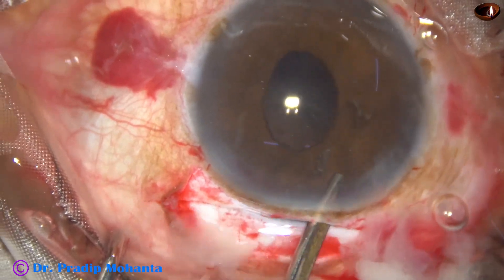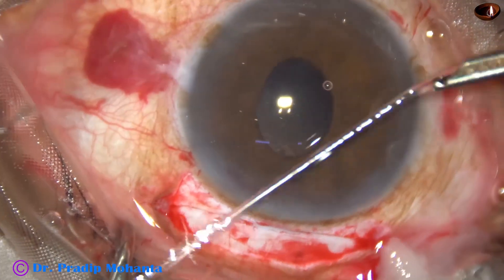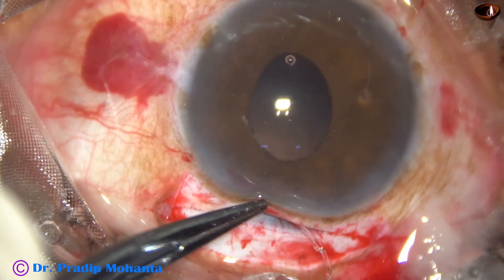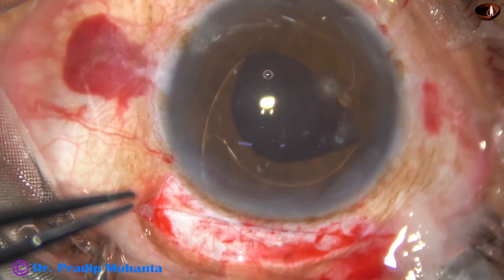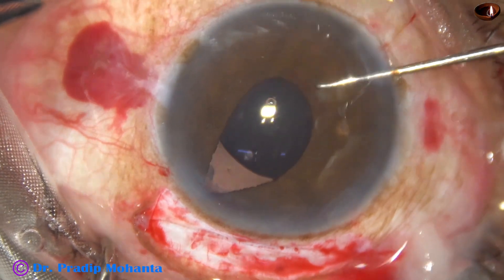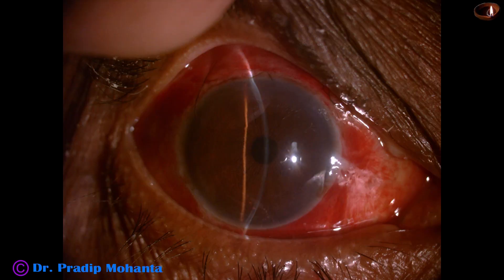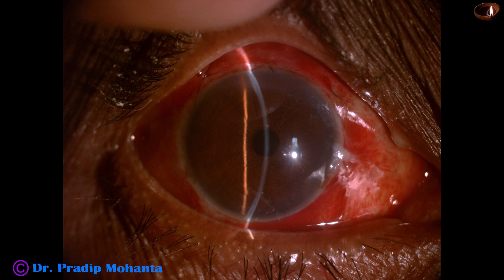Cortical cleanup is done and an intraocular lens is placed — in this case, a 6 mm PMMA lens placed in the sulcus. The lens goes into the sulcus, and the patient did very well in the postoperative period. There was very mild corneal edema.